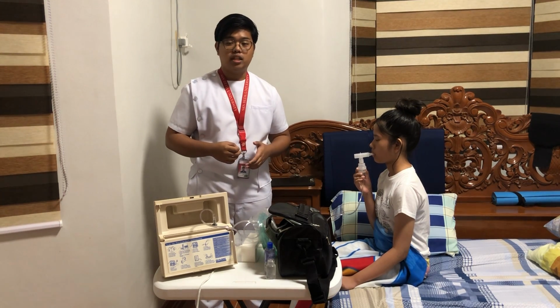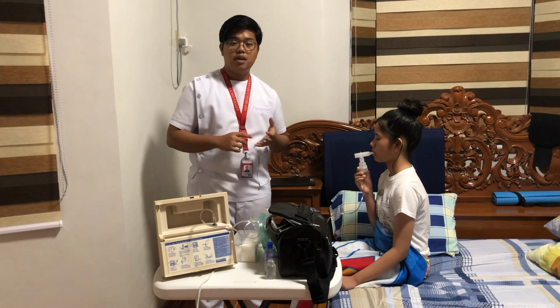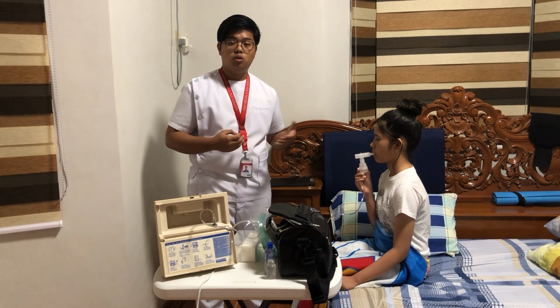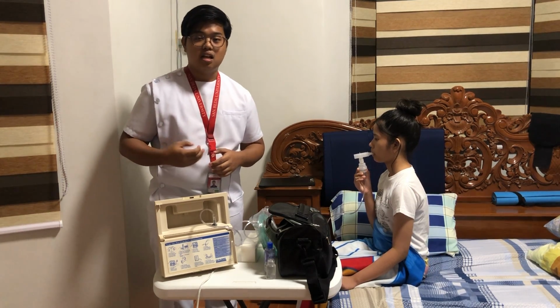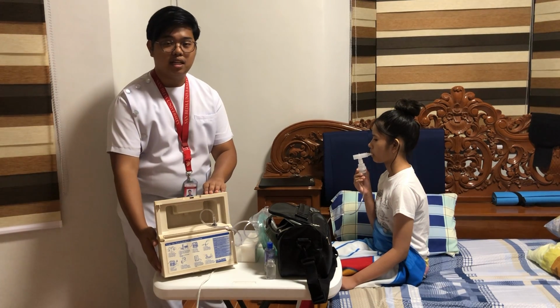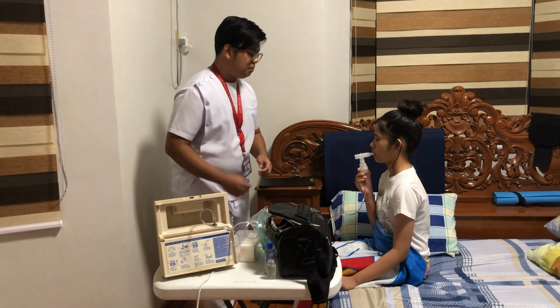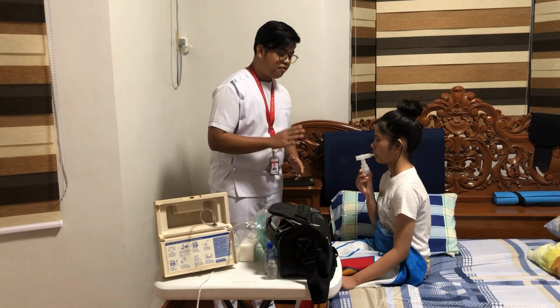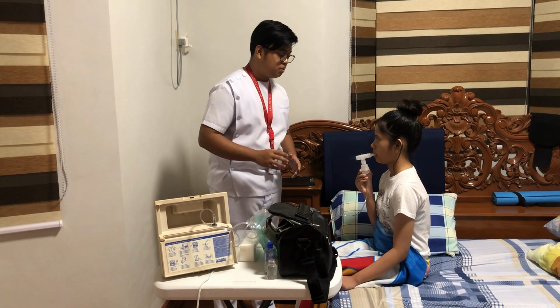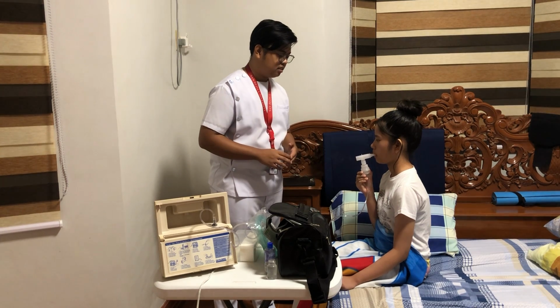And then after that, with either the delivery system, either the mask or the mouthpiece, the patient should inhale slowly through her mouth and hold each breath for at least 1 to 5 seconds before exhaling through her mouth. So we'll begin the nebulization process. Ma'am, you need to inhale slowly, and then hold at least 5 to 10 seconds each breath before exhaling.